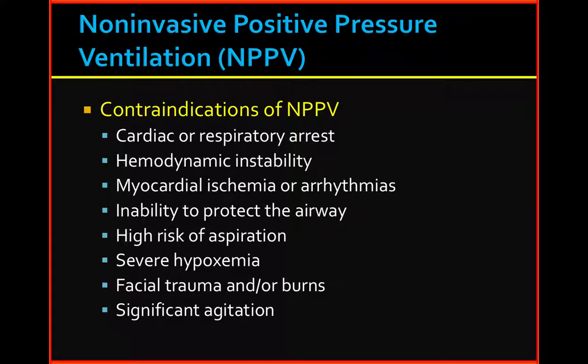Increase the rate. If they're breathing more times a minute, then they'll help get rid of some of that CO2. That's one of the ways, yeah. Let's look at what this gas is showing us. At 7.28, the pH is acidotic.